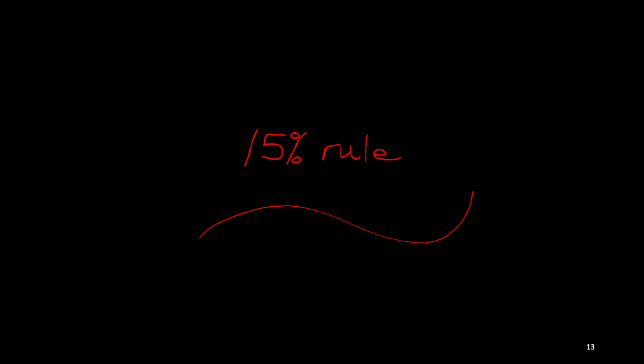So it's very important to always do both. If you increase kVp, you're going to do what? You need to decrease your mAs. If you're going to decrease kVp, you need to increase your mAs.